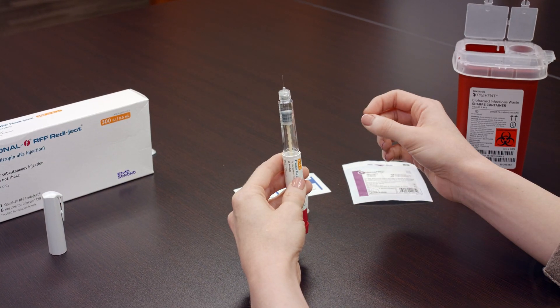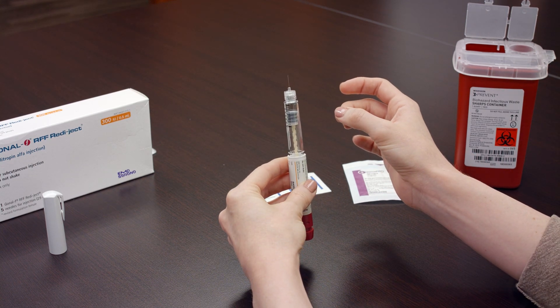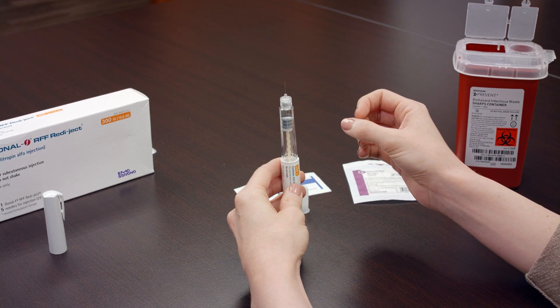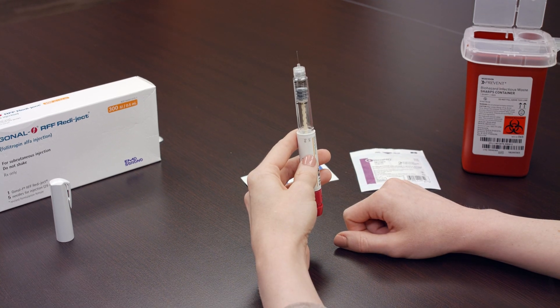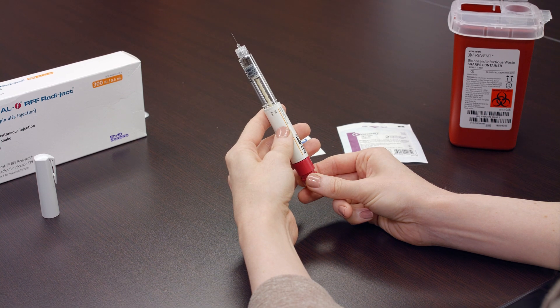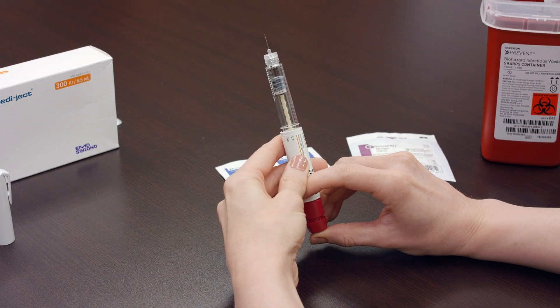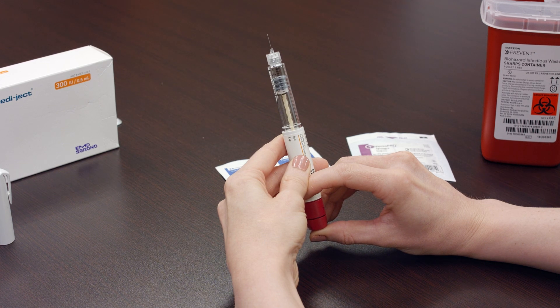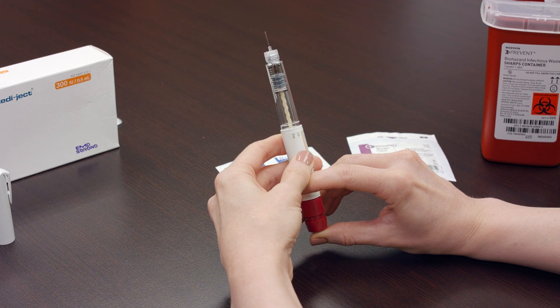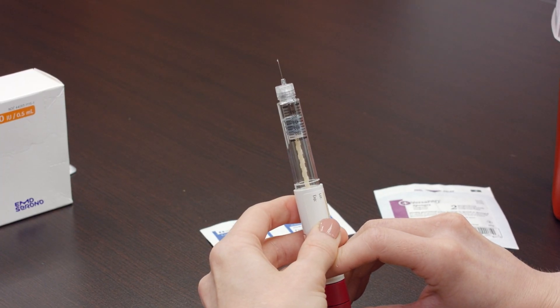Invert the pen and hold it upright. Gently tap the side of the pen to bring any air bubbles to the top. While continuing to hold the pen upright, turn the dosage knob until you hear one click. Press on the administration button until you see a drop at the tip of the needle. If needed, repeat this process until a drop is formed in order to administer the correct amount of the medicine.